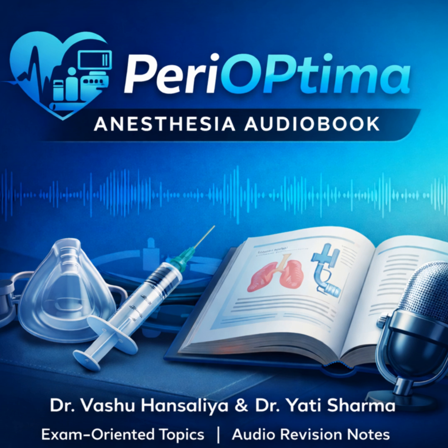But the reality is, even the most advanced technology can fail. So how do we stress the importance of vigilance, even with all these safety systems? Clinical vigilance and cognitive preparedness are the ultimate safety system. Safety isn't a feature on a machine, it's a process in your brain. So using things like the ASA difficult airway algorithm. Yes, using cognitive aids, having a preemptive plan for everything, especially for extubation and potential reintubation, because even the best machine can be defeated by a problem it wasn't designed to solve.